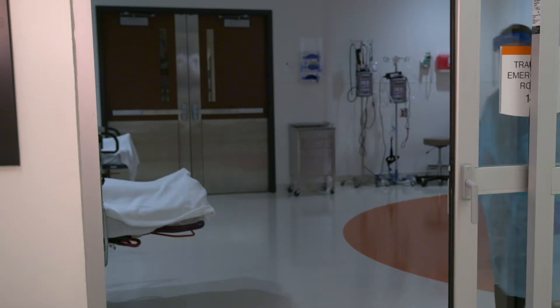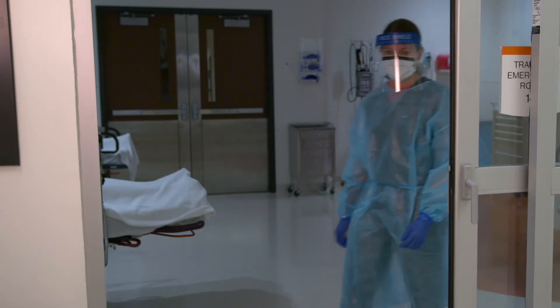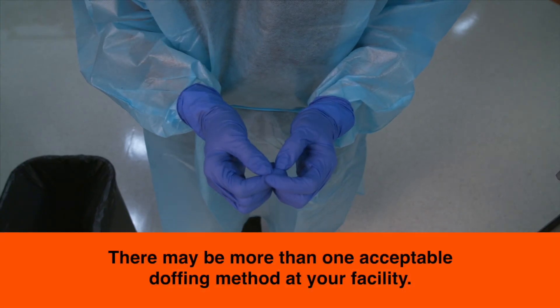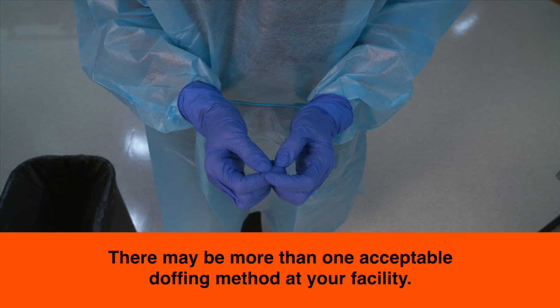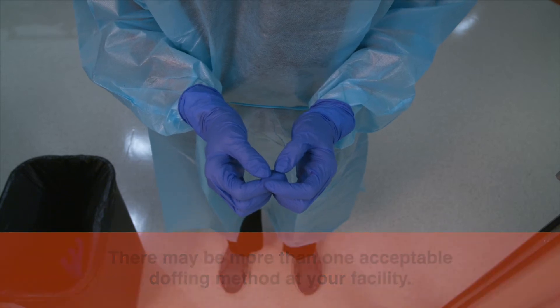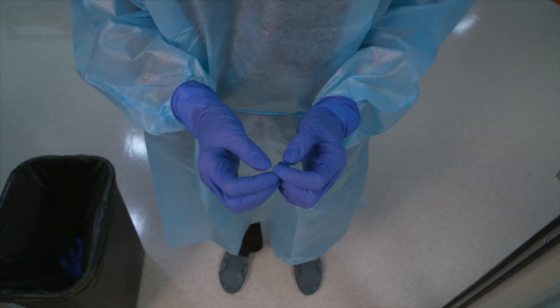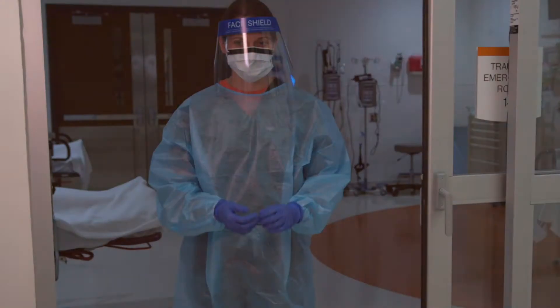When it's time to leave the protected environment, you'll need to safely remove your PPE. This is called doffing, and there may be more than one acceptable doffing method at your facility. It's just as important to understand doffing procedures as it is donning procedures. A wrong move here can spread contaminants to others.